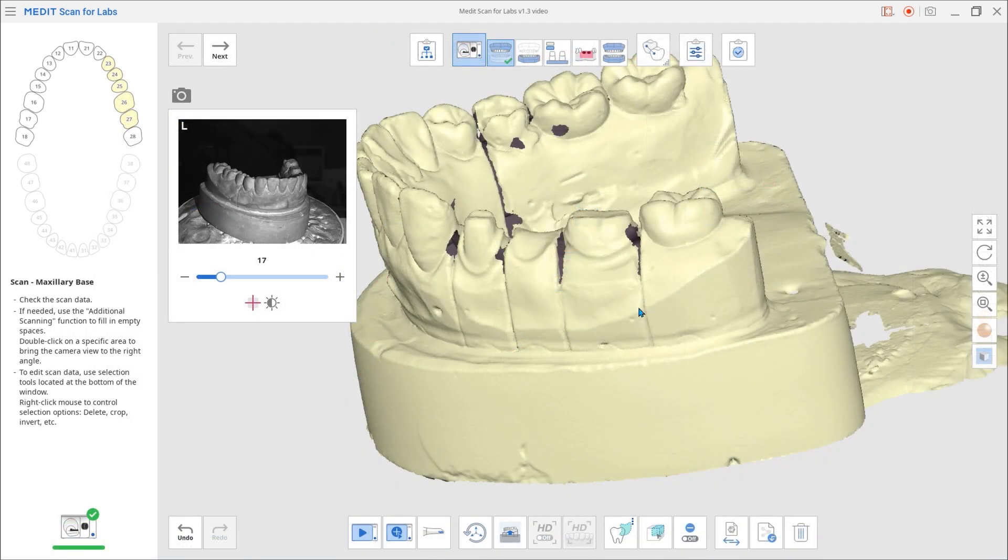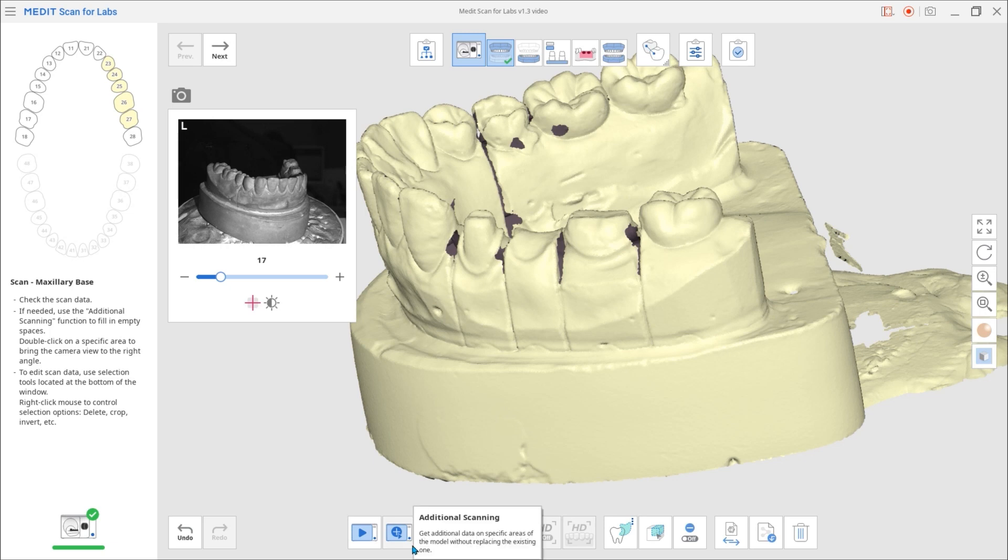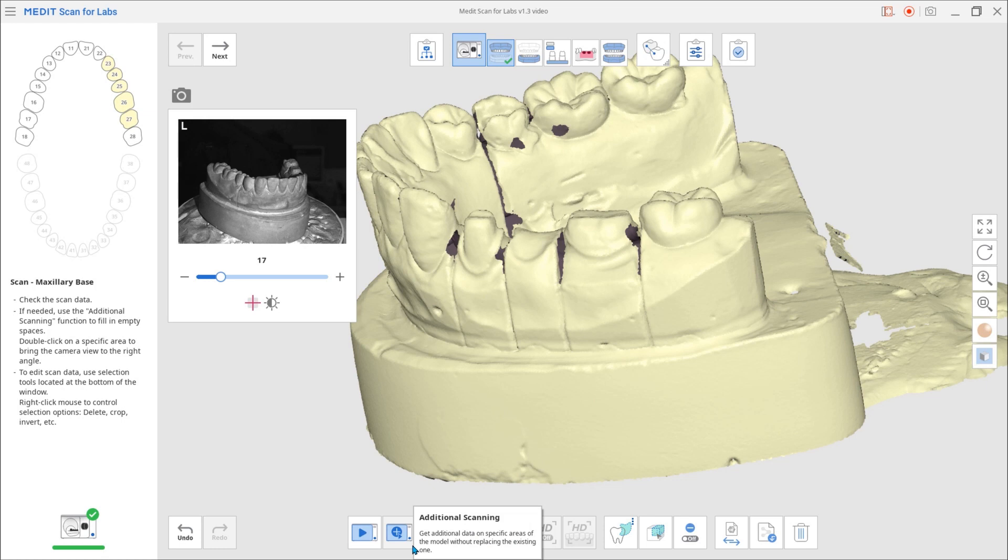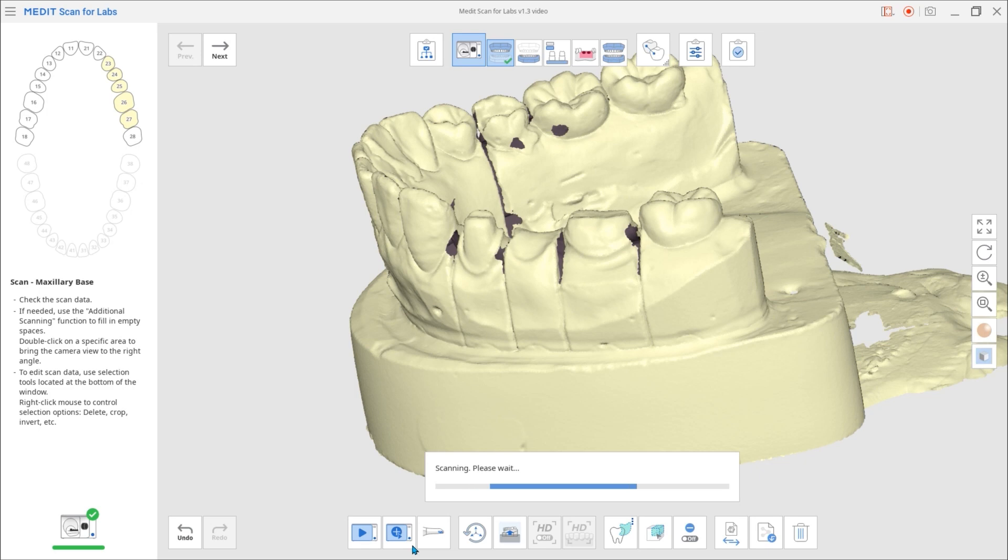Next, we have the Improved Additional Scanning feature. Just as before, this feature allows you to capture additional scans if the initial one has missing data parts.